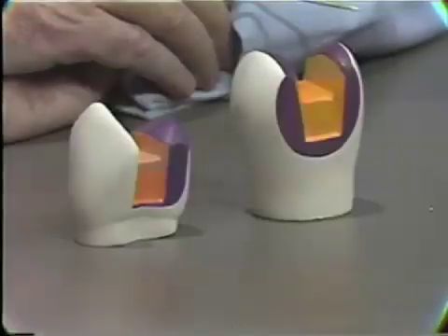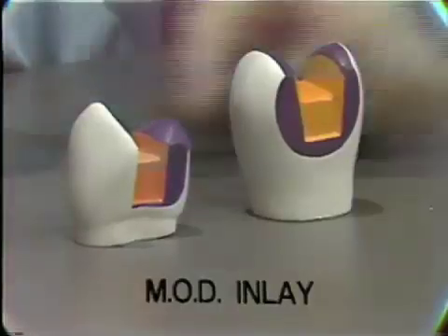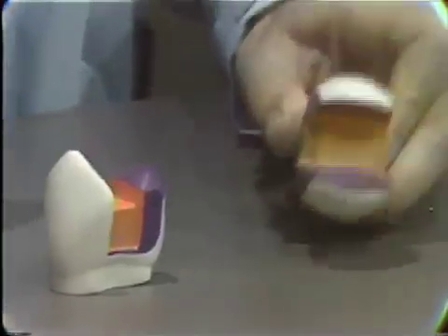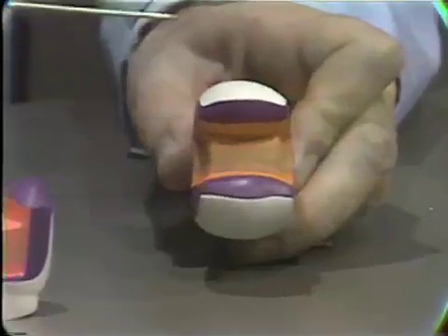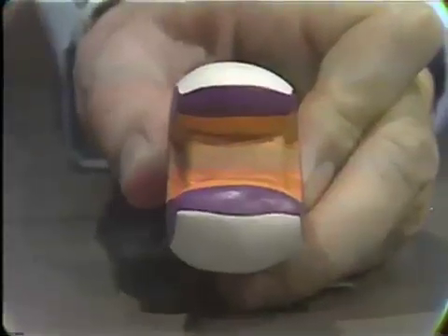The MOD inlay is a useful retainer in teeth where previous restorations may have been present. And you see here two examples of MOD inlay restorations on bicuspid teeth. Take this one, for example. Possibly a bicuspid tooth in the mouth might already have an MOD inlay or an MOD amalgam in position.